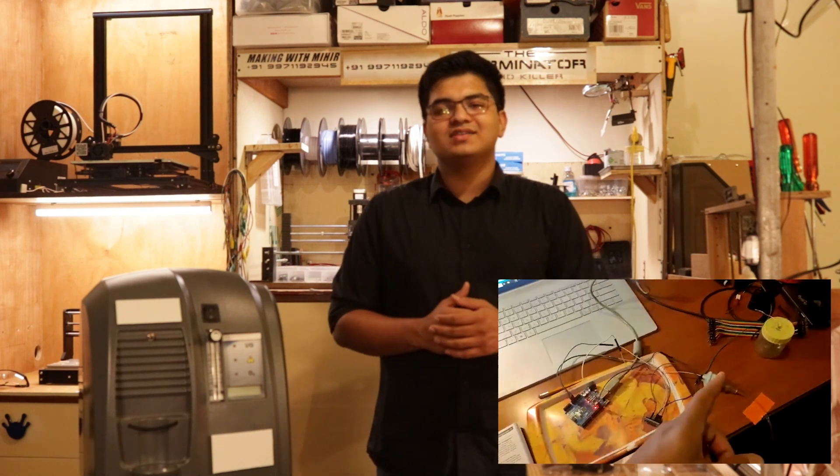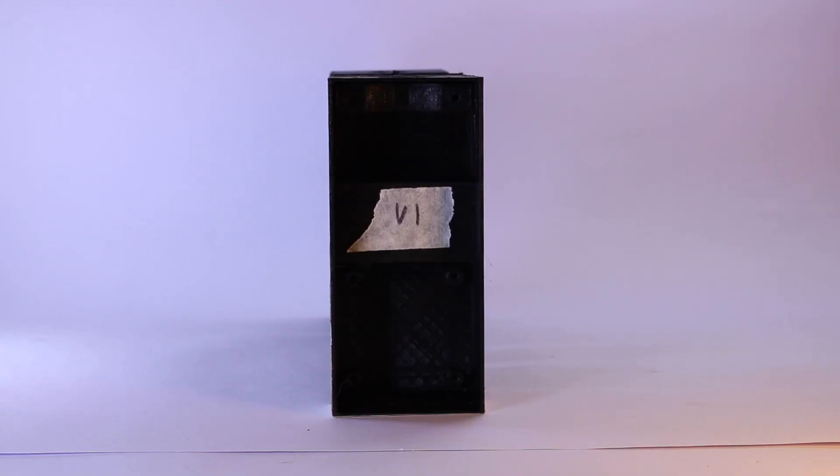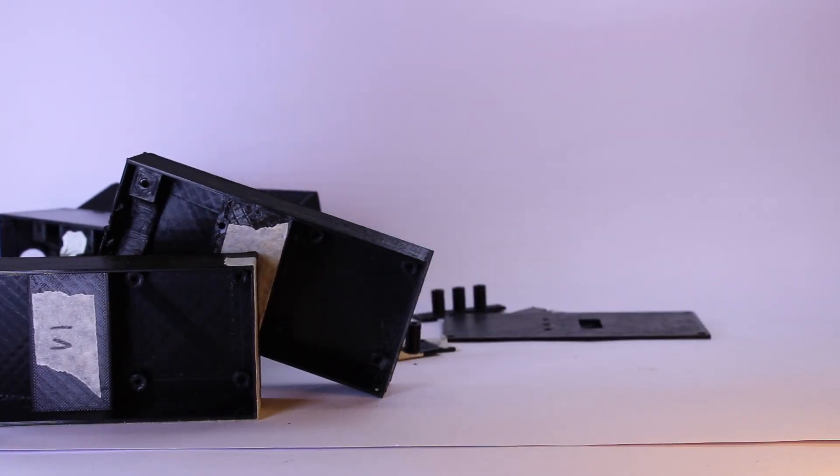Getting this thing to be a product prototype and not an Arduino with a mess of wires took days of hard, painful CAD modeling. Before we got to this questionably good-looking version, we had failed versions 1, 2, 3, 4, 5, and a bunch of random failed parts. It was hard.